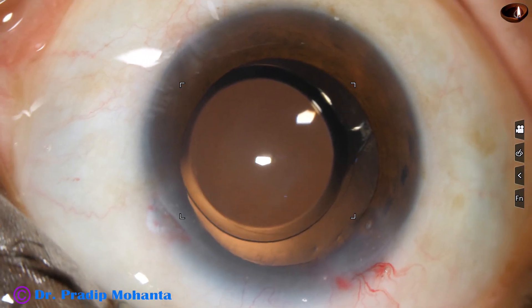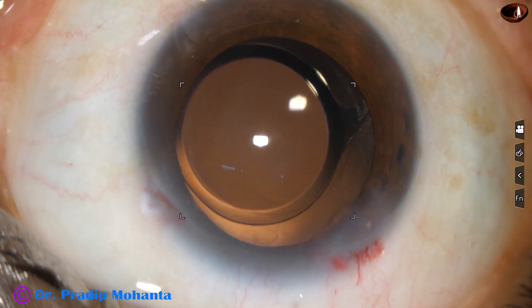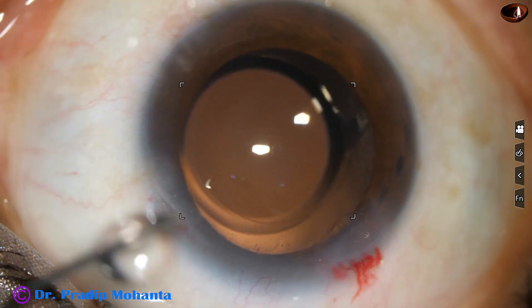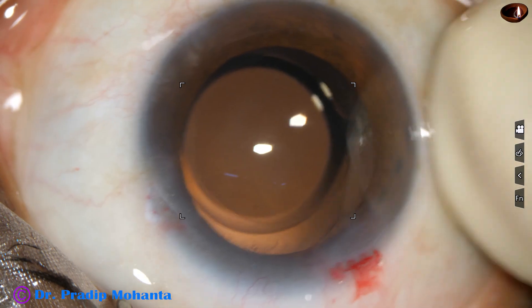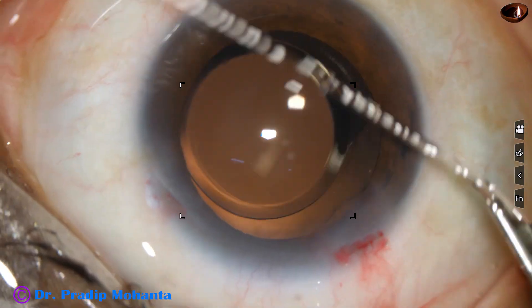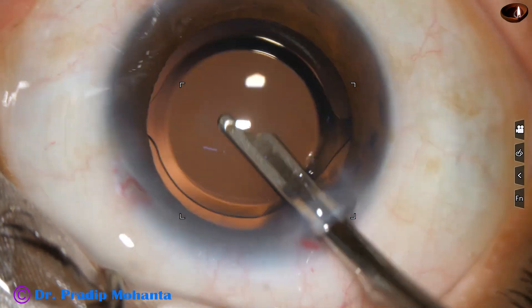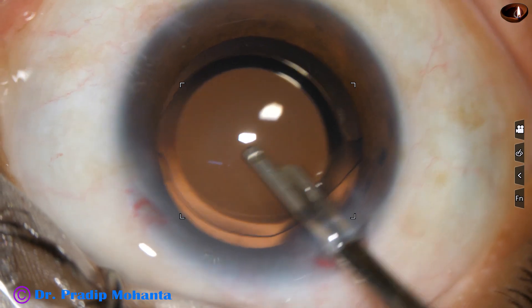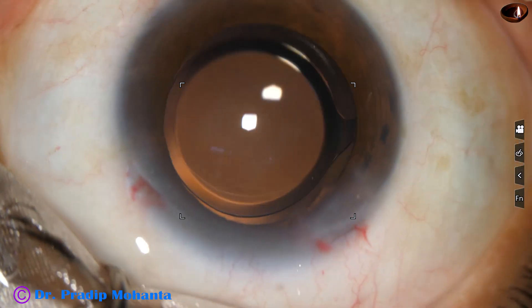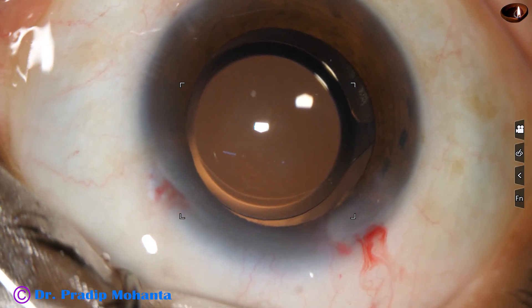It is done. And now a bit of moxifloxacin is instilled. The side port is closed by hydrating the corneal stroma with BSS. A final lavage of the entire chamber is done. The entire chamber is formed very nicely and the intraocular lens is centered. With the Simcoe, the anterior chamber is formed. Intraocular pressure is checked. The integrity of the wounds is verified and the case is concluded.